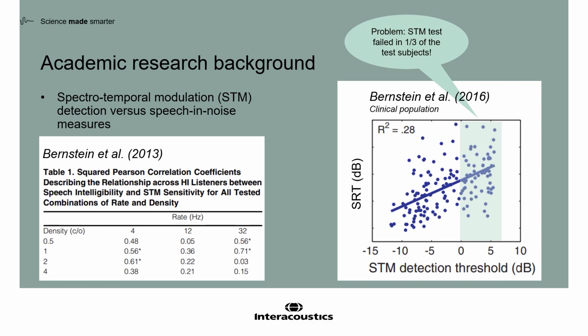However, there were problems with this early version of ACT. A body of literature on STM was studied, and there was interest gained in this in 2013, where they were showing correlations between early versions of ACT against other speech and noise measures. The results from this more controlled, carefully recruited group of test subjects showed correlations were very high with beyond the audiogram measures.